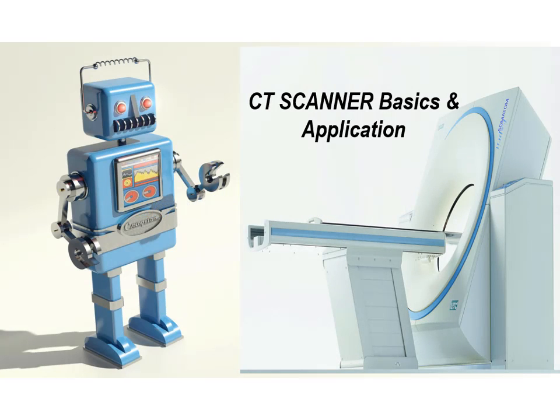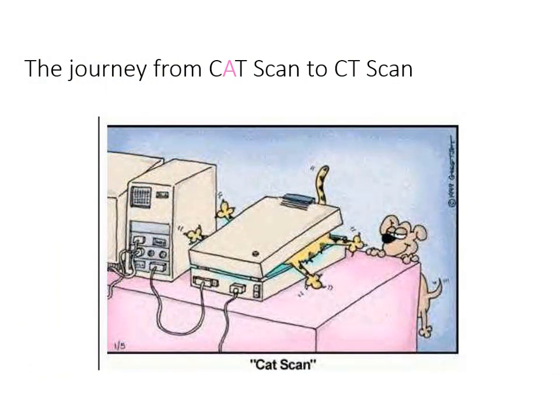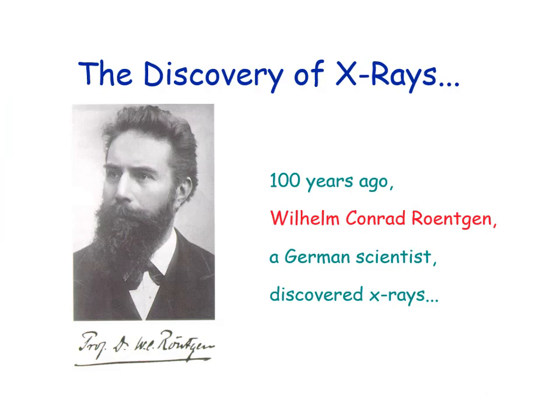Computed tomography. CT scanner basics and application. The journey from CAT scan to CT scan. 100 years ago, Wilhelm Conrad Röntgen, a German scientist, discovered X-rays.